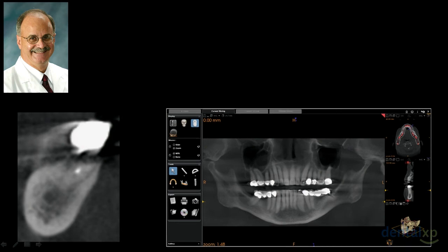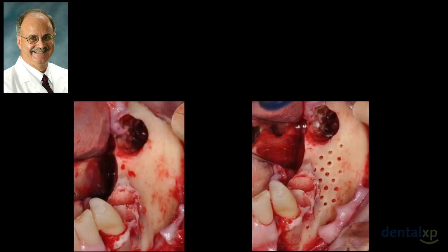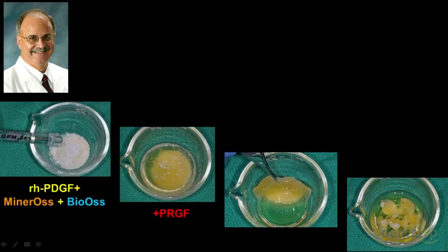How bad is that deformity? Is it 3-dimensional truly? Is it a width and a height deficiency? Is it only height, or width rather? And if it's width, is it facial? Is it lingual? Et cetera, et cetera. So here we have a width deficiency, and in extracting the distal molar and the bicuspid up front, site preparing, we can use a combination of materials as you're seeing here.